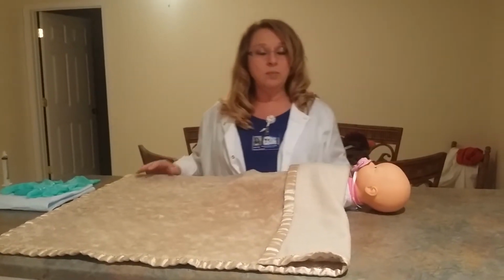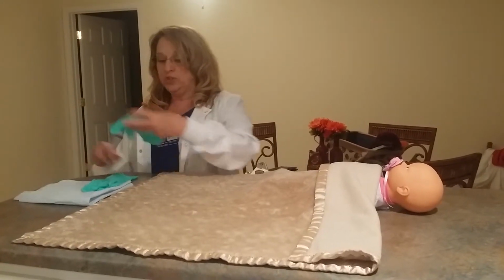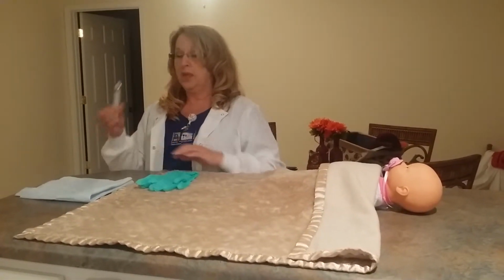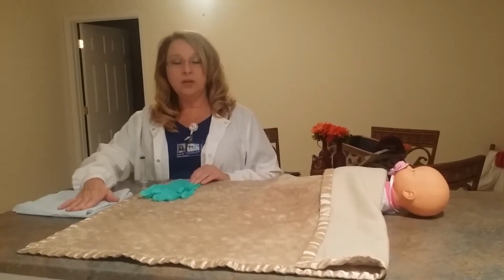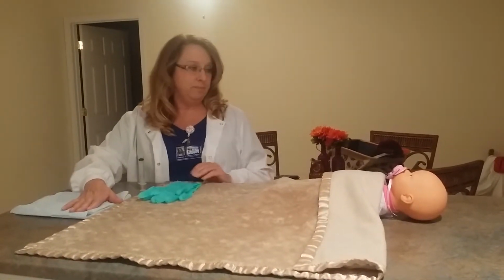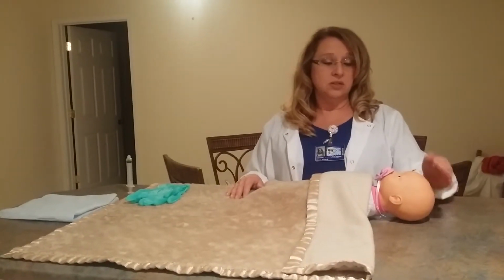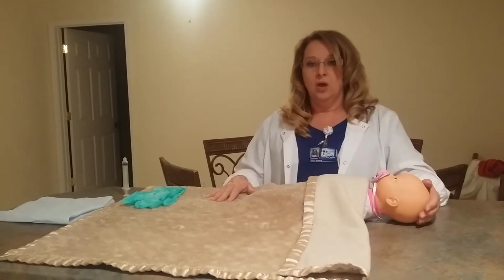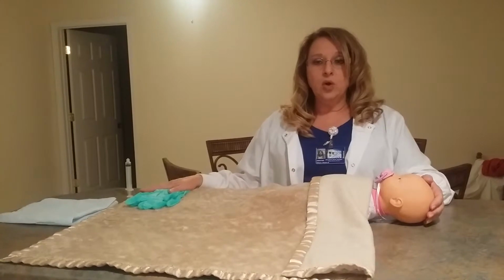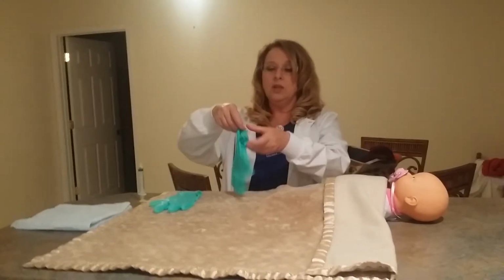The procedure for removing the catheter starts out with gathering your equipment, which includes gloves, a 10 ml syringe, and a fluid impermeable pad to put under the patient. Today we have a pediatric patient in lieu of an adult subject, so we'll just pretend this is an adult. After we've gathered our equipment, we've performed proper hand hygiene, put on our gloves.